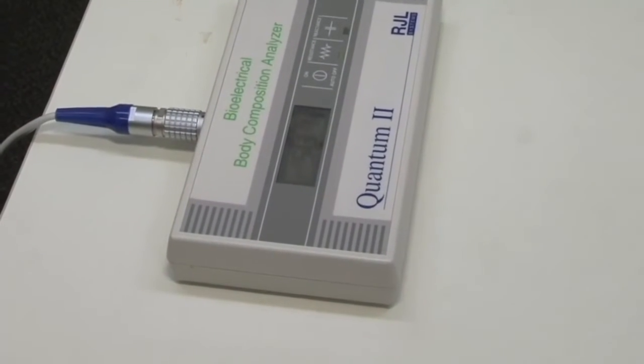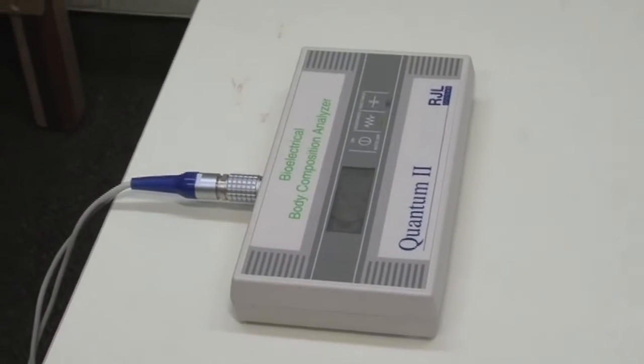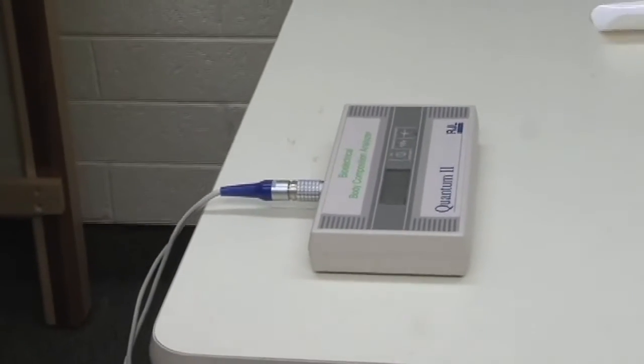That number by itself doesn't mean anything, but we take that information and put it into an equation. Other information we would need for the equation is her height, which is critically important because, as with any electrical current, the resistance to that current is dependent on the height and the cross-sectional area of the cylinder. In this case, the electrical current is going through her arm, down the side of her body, over to her legs — so we're really measuring the whole body, or half the body, and then making a prediction based on that measurement.